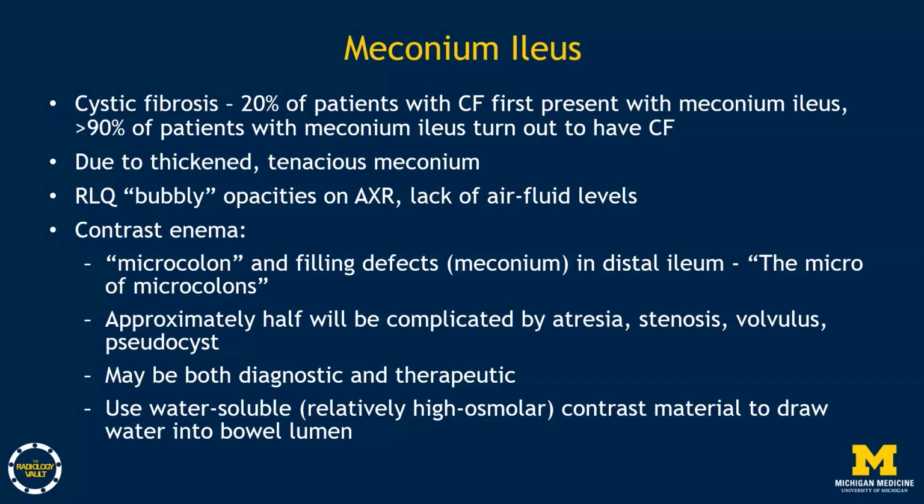The contrast enema can be both diagnostic and therapeutic. We start with a diagnostic enema, and as we mentioned, we're using water-soluble contrast. But with water-soluble contrast that is relatively higher in osmolality than plasma, this allows water to be drawn into the bowel lumen, helping to loosen up the meconium and hopefully treat the obstruction.